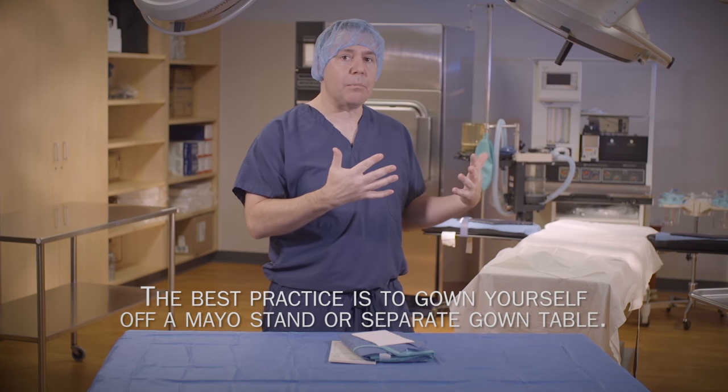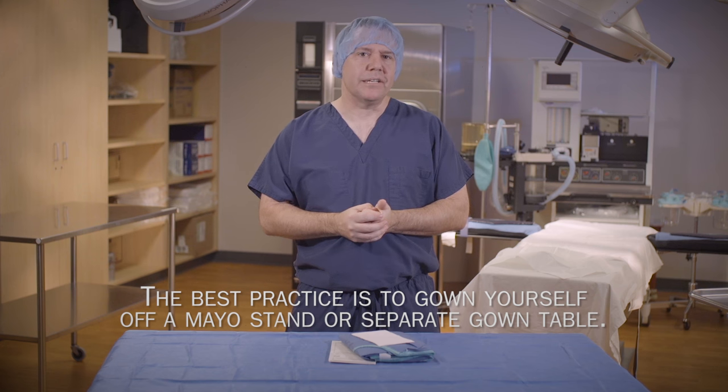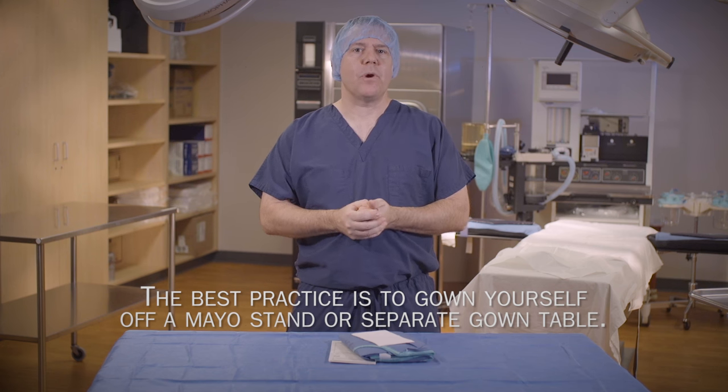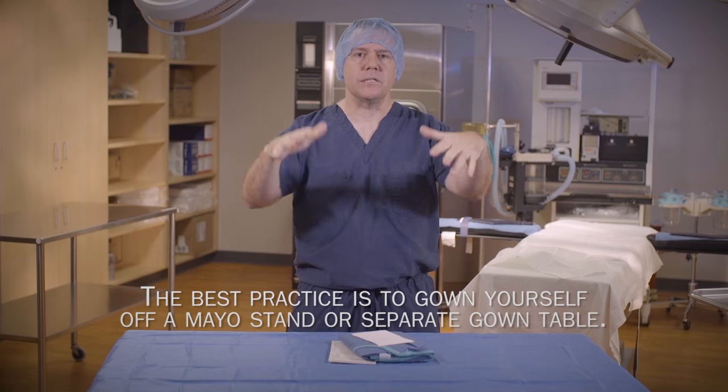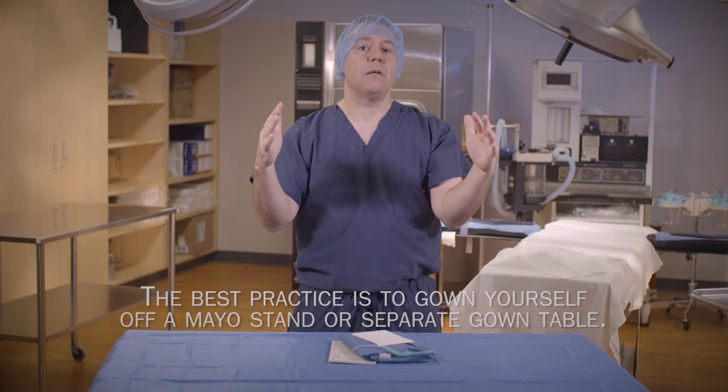Now normally I would be backing into the operating room, but since this is a lab, I'm going to just simulate it. Make sure that when backing into the operating room, my hands are above my elbows and are between my axillary line and my waist, and I will stand always 12 to 18 inches directly in front of the back table.